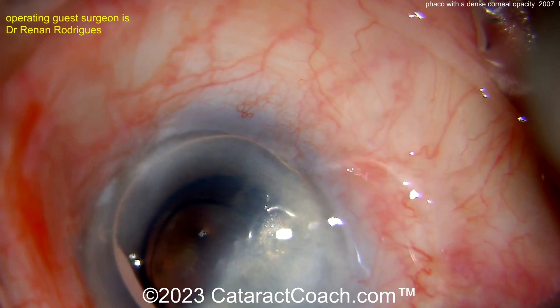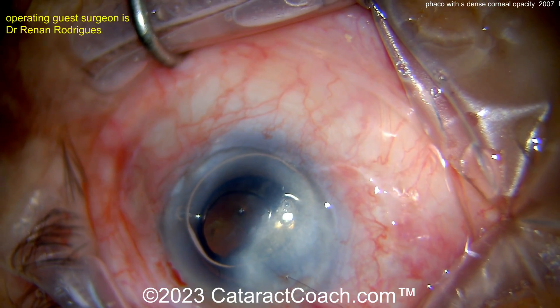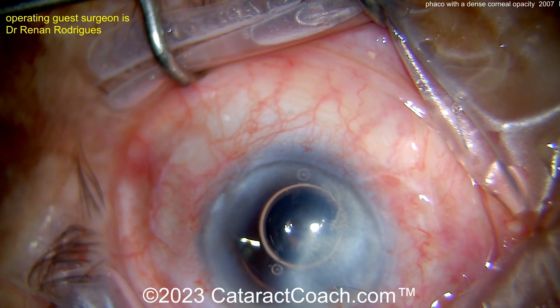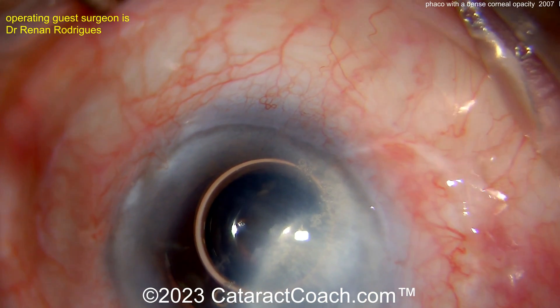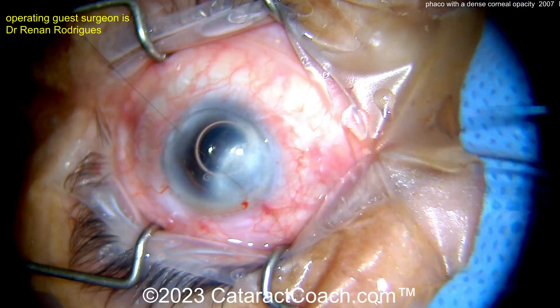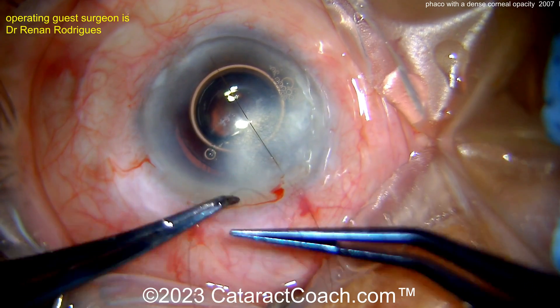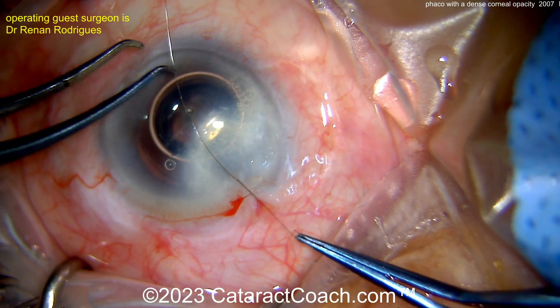There's the 10-0 nylon. Beautiful — very nice. I also like that air bubble in the AC at the end of the case. That's going to help ensure things go well and you won't have iris prolapse as you suture the incision. Nicely placed suture — tie that up securely. One suture probably ought to do it. This patient is going to have a beautiful post-op outcome. Really great case.